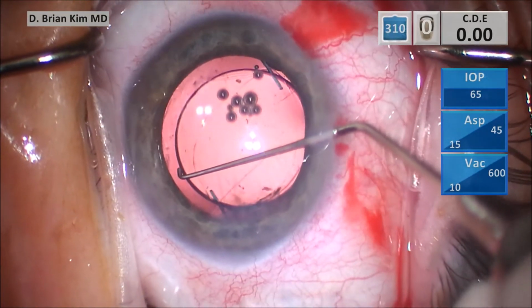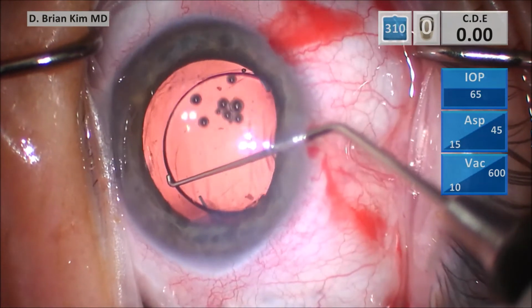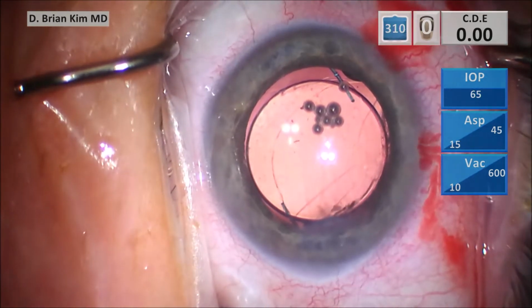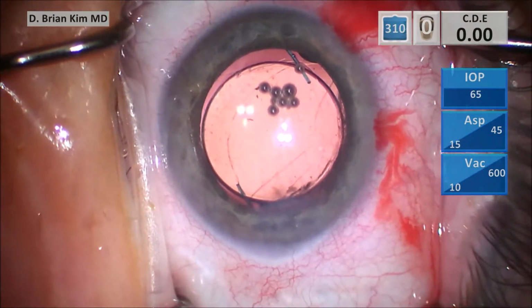So I'm trying to reposition the lens, making sure I get good overlap so that the optic is in a true optic capture configuration with the haptics in the sulcus.